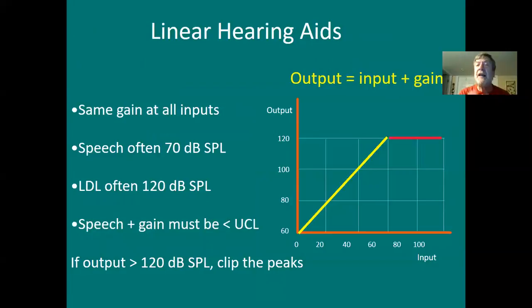Linear hearing aids were the state of the art all the way until the early to mid 1990s. This is not long ago. Okay, this is barely more than 20 years ago. All hearing aids were linear.